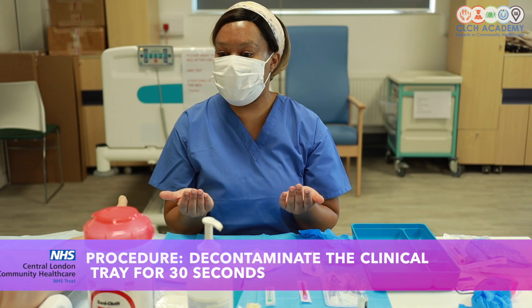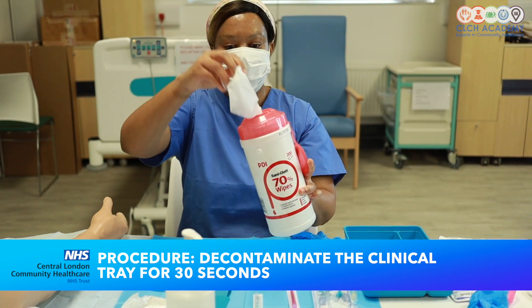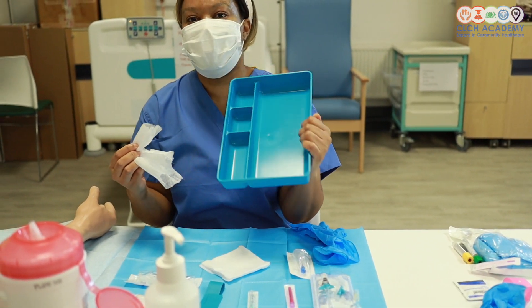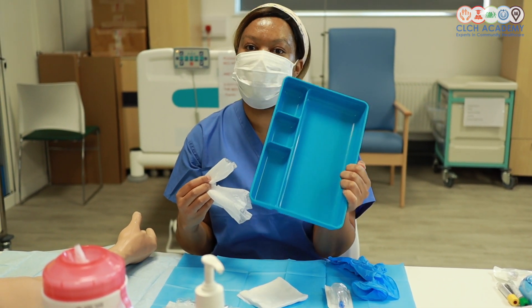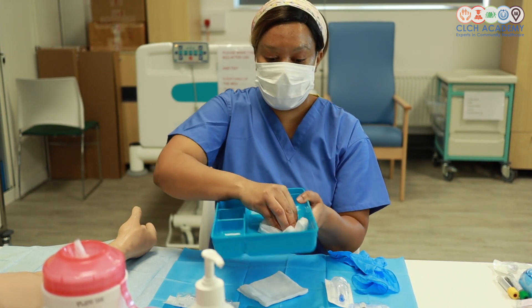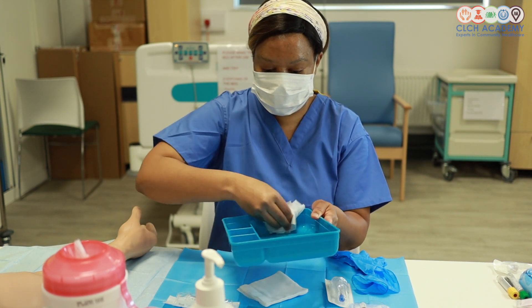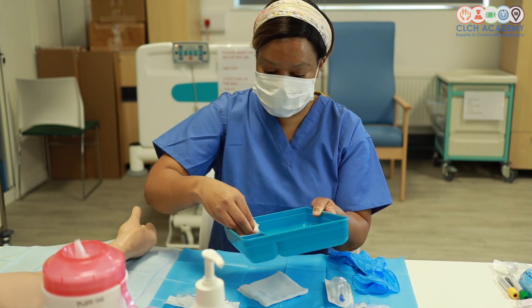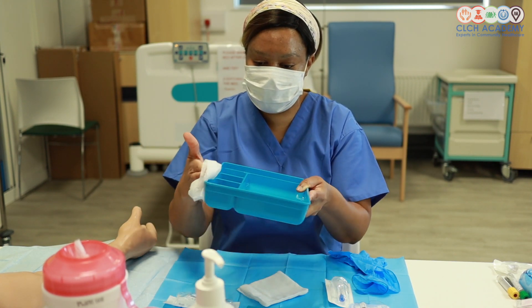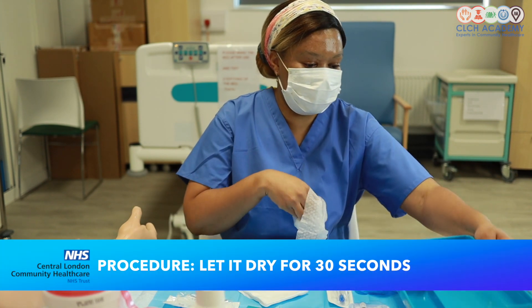First, I'm going to decontaminate my environment and prepare my tray for the process of cannulation. If my tray was visibly dirty then I would wash it with soap and water. However, if the tray has been washed with soap and water and it's actually clean, I'm just going to wipe that down with my alcohol wipes, using the technique of inside — making sure you're getting into each compartment — and then outside, doing that for approximately 30 seconds and allowing that to dry.